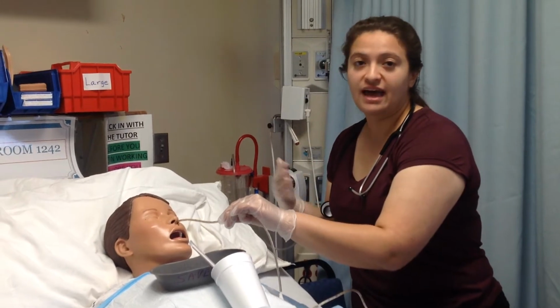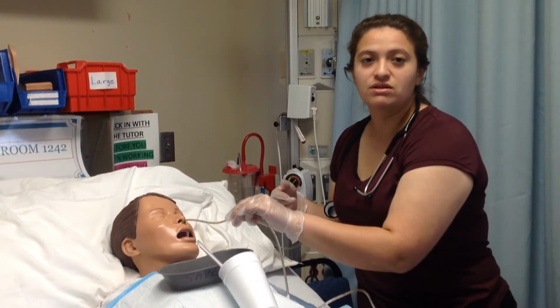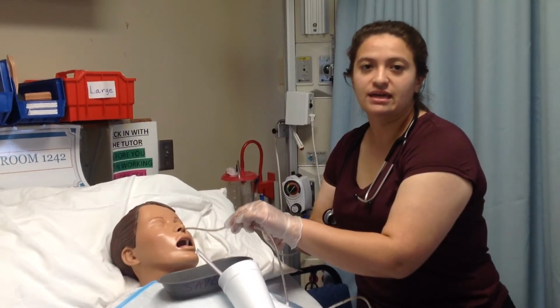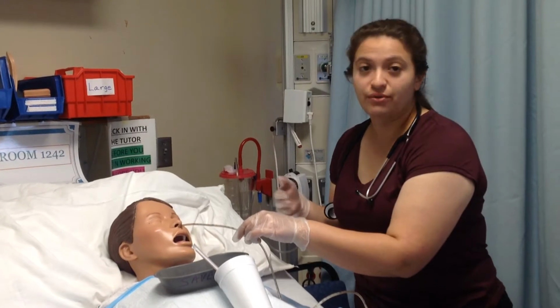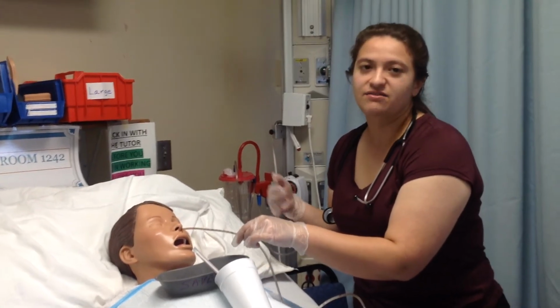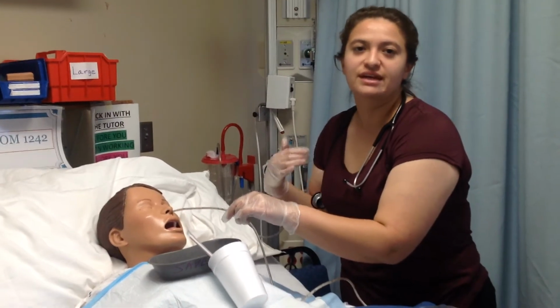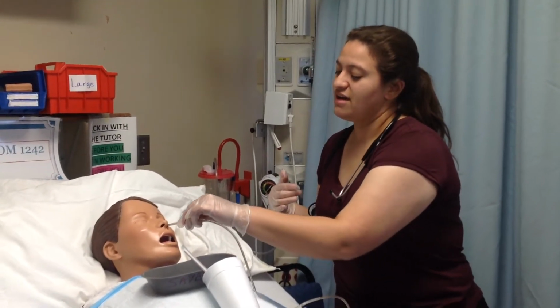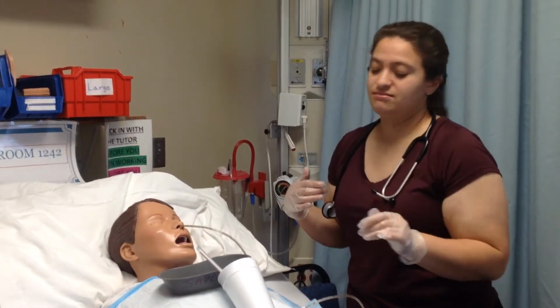once they start to feel the gag reflex, they would go ahead and start to swallow. And I would say swallow, swallow, swallow until it's all the way in. And I would have them bring their head forward as they start to feel that gag reflex to help it finish going into their stomach. So I'd have them move forward. So that's how far the tube goes.